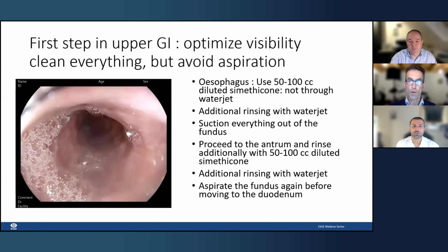Yes, I would like to encourage the endoscopist to look at the screen as much as possible, because there's always a blind moment when you switch from looking into the mouth of the patient onto the screen. You don't know what happened then, and then you can be lost. So I would like to enforce that you try to stick to viewing the screen. Yeah, I totally agree.